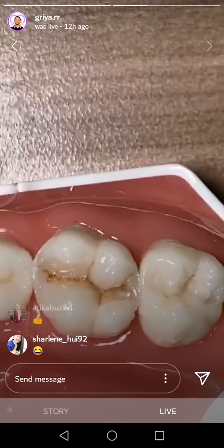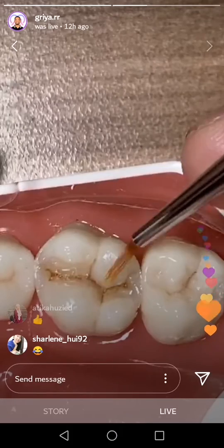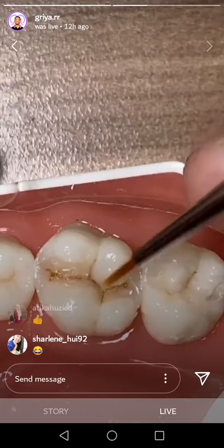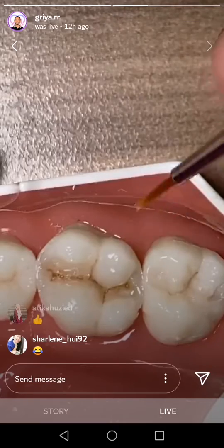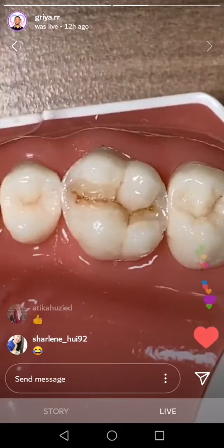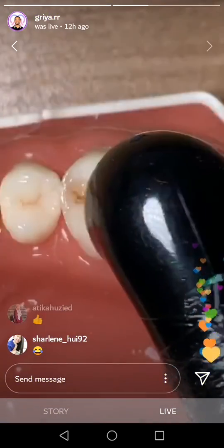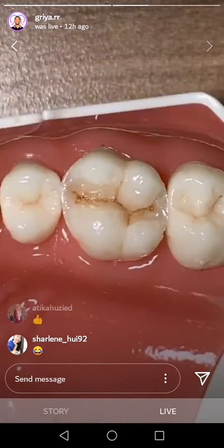Okay, that's ready. That's done. And before you want to cure, don't forget to always do this, okay? Make it smooth again, smooth. Okay, now cure again. I will explain very clear and very simple. I hope you can understand. Now let's go to the other, yeah.